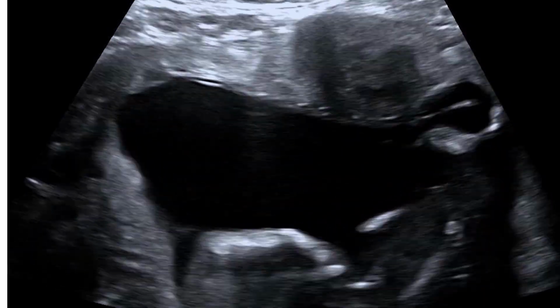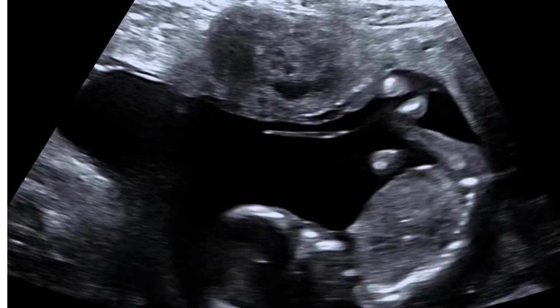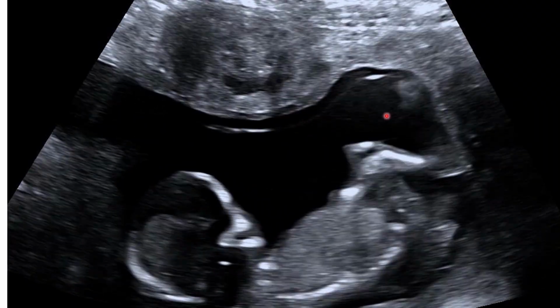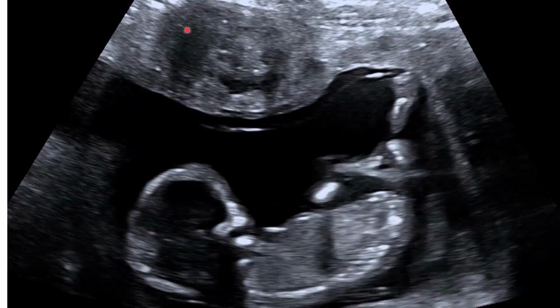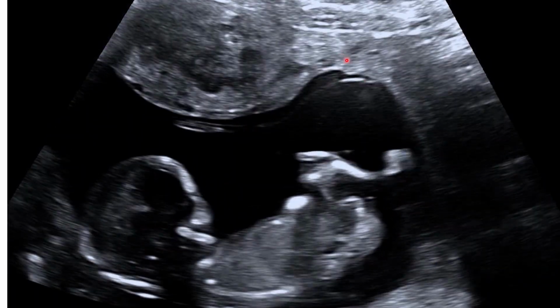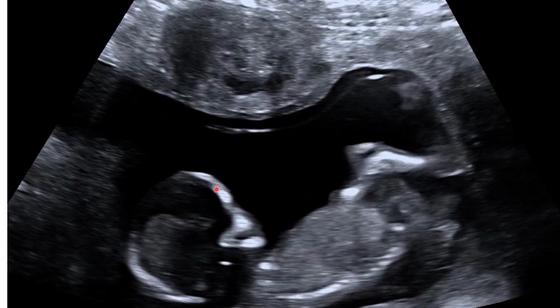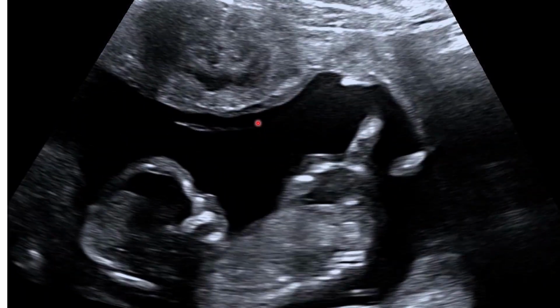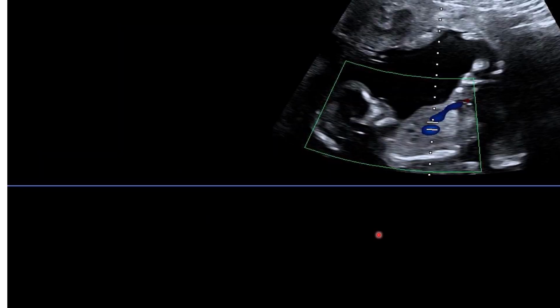So during this period, we also screen for Down syndrome and also for preeclampsia. So what I wanted to demonstrate is the existence of a fibroid with pregnancy. If these fibroids are too big, they compete for space with the developing embryo, and they can cause a miscarriage. Look at the foot developing nicely there.